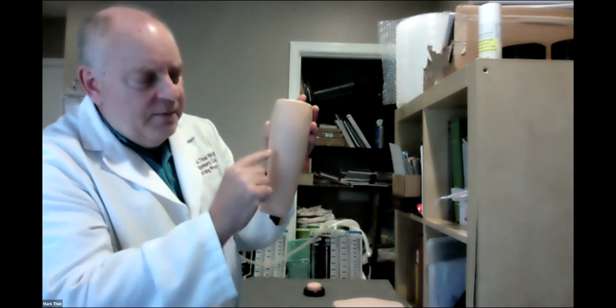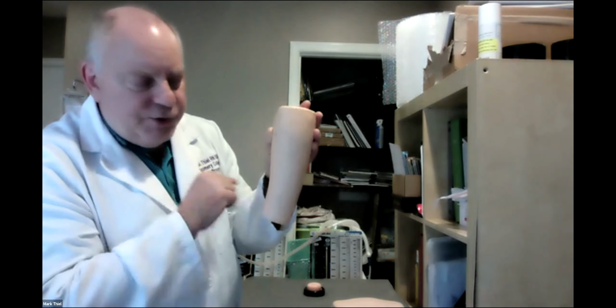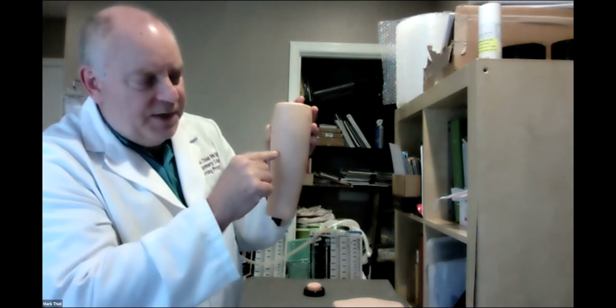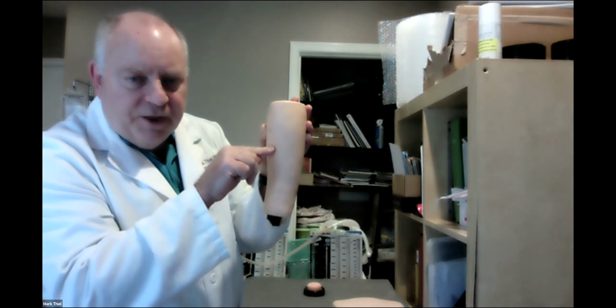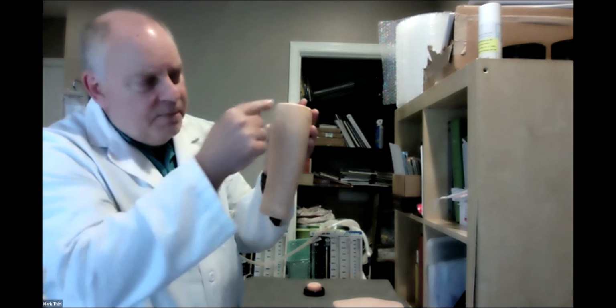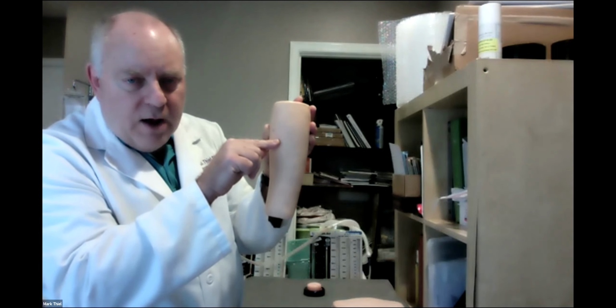If you were to divide from the groin area to the knee, you would divide it into thirds, and the injection will be in the middle third, cast to the outside of the thigh, right there. Once again, femur bone middle, cast about 1/3 of the way around to the outside of the thigh, vastus lateralis.